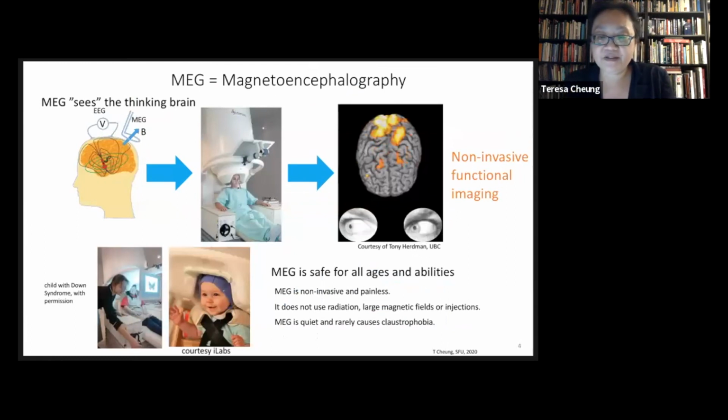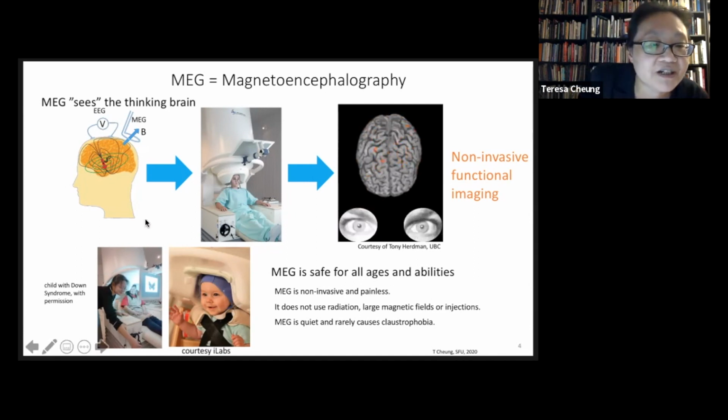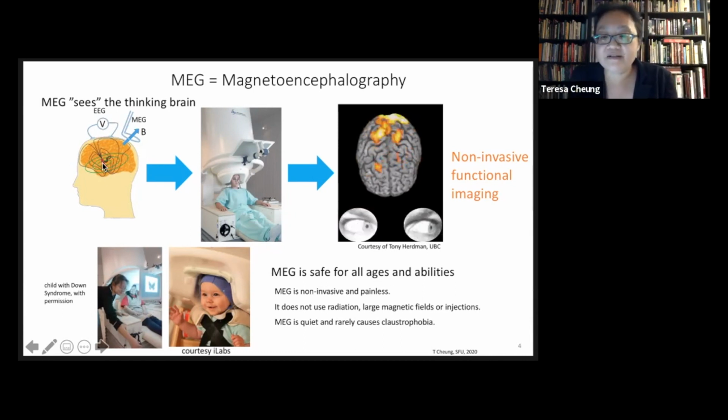So what is MEG? Well, MEG stands for magnetoencephalography. That's a mouthful. It turns out that your brain produces electromagnetic signals. When you think, neurons create currents. And in this cartoon shown here, I'm showing a current in red. This red arrow represents a bundle of neurons firing. This bundle, for example, could represent normal brain function, such as hearing a sound, or looking at a picture, or understanding words. But this bundle of neurons could also be activated and be the location of irritative tissue that may be the cause of a seizure.